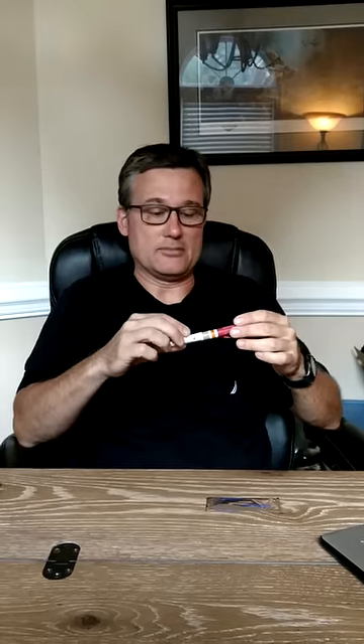It comes in a nice hard container, so you can use it as a sharps container if needed. It's 3.25 inches long, which should be adequate for our purposes. It's a 14-gauge catheter — that's what's recommended by TCCC.